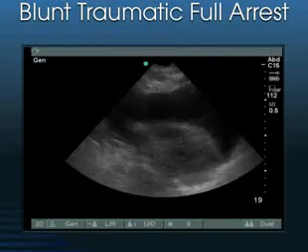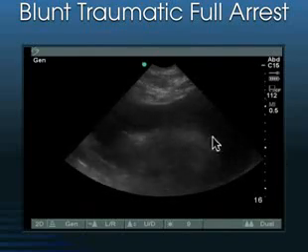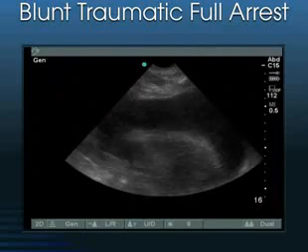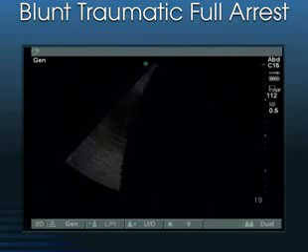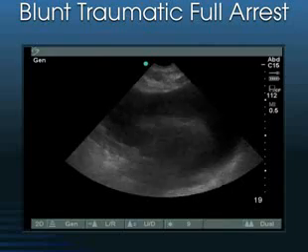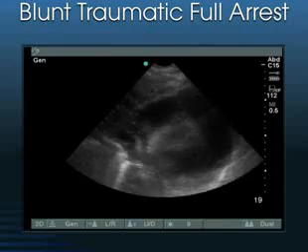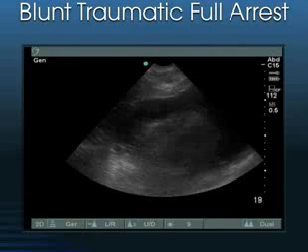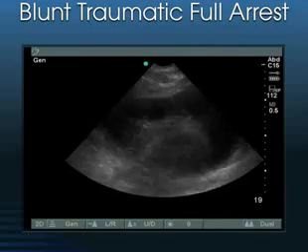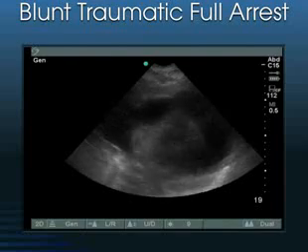Well, in this particular patient here, they didn't actually have a pulse at all. We felt no carotid pulse, yet we saw this heart beating around quite a bit, swinging around in its sac of fluid there. Clearly, this is pericardial tamponade. In the setting of blunt trauma, it was a little bit confusing. When you look at the mechanism a little bit closer, the patient wasn't wearing a seatbelt, hit the sternum, and probably a rib fractured and poked the pericardium, causing this pericardial tamponade.